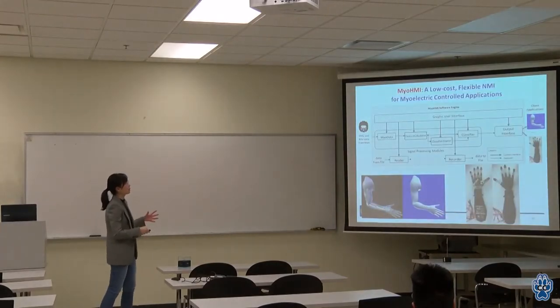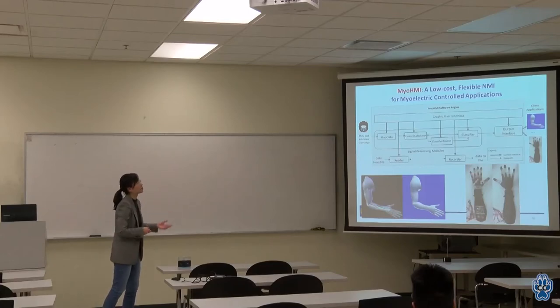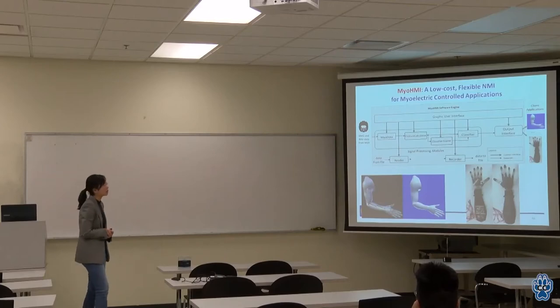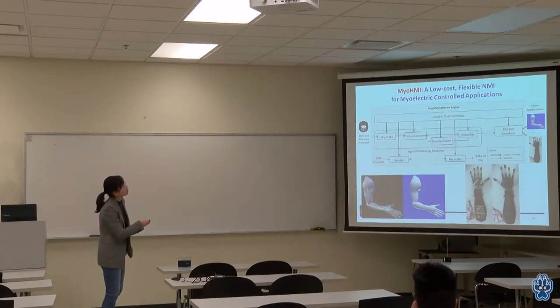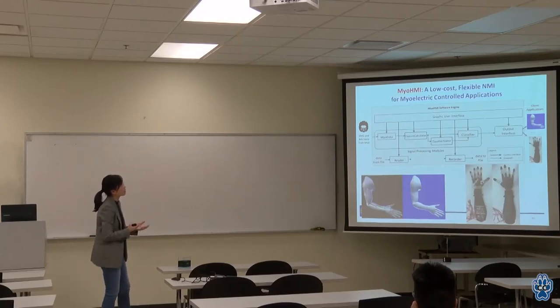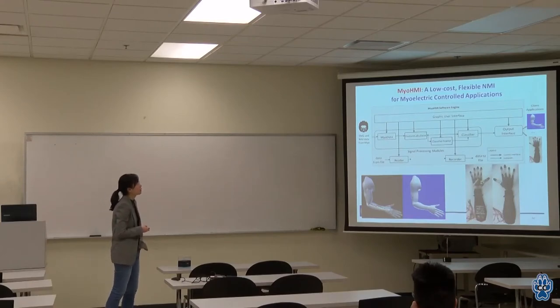So this is the PC version of MyoHMI, mainly developed by these interns and mentored by one graduate student. This platform has a GUI, and then it has several modules. All these modules are highly modularized, and they can be easily changed if needed. We have data acquisition, and then feature extraction, classification, training and testing, and then output control. With this output control, we can make decisions to control devices.